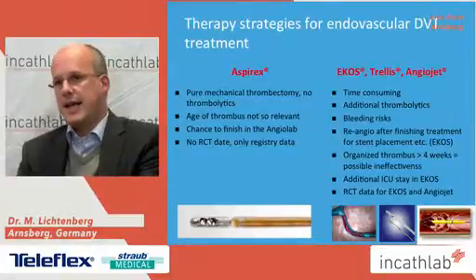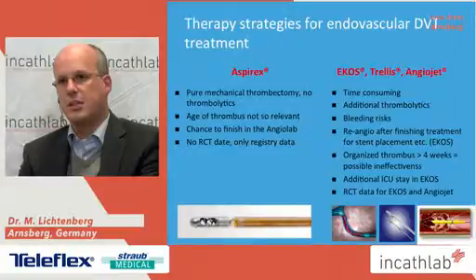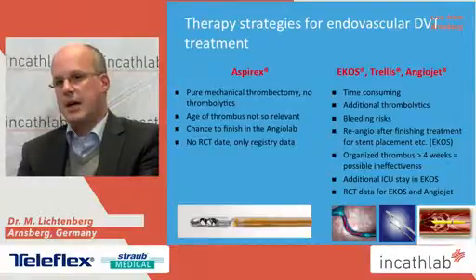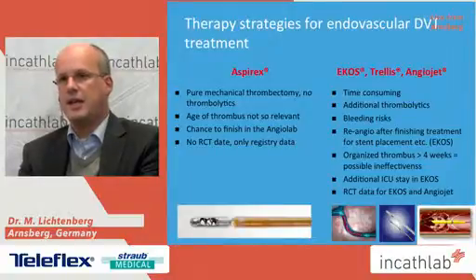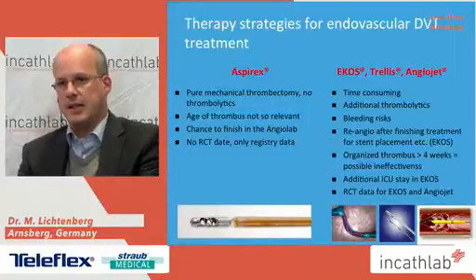We see that the Aspirex has some pros in comparison to other thrombectomy devices. This is a pure mechanical thrombectomy device. The age of the thrombus is not so relevant. We even treat patients with a thrombus age of 3 months. We have a chance to finish in the cath lab. The problem is we do not have any randomized controlled trial data today, so we definitely need these data in the future.